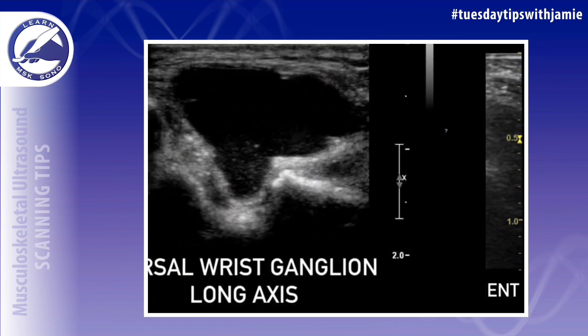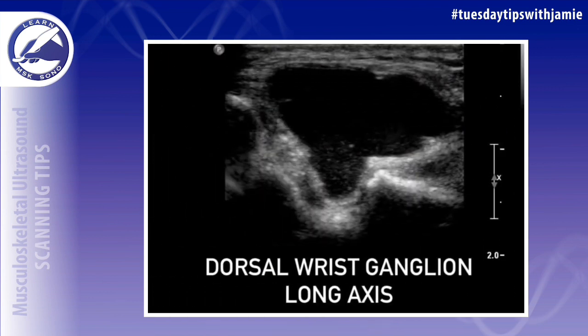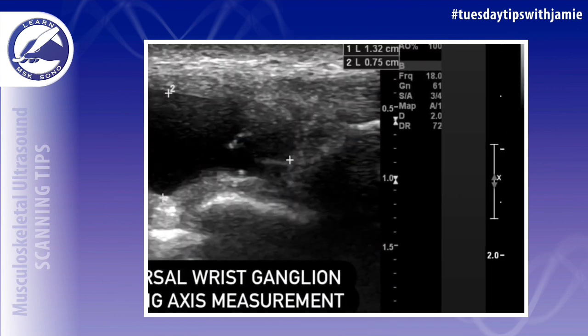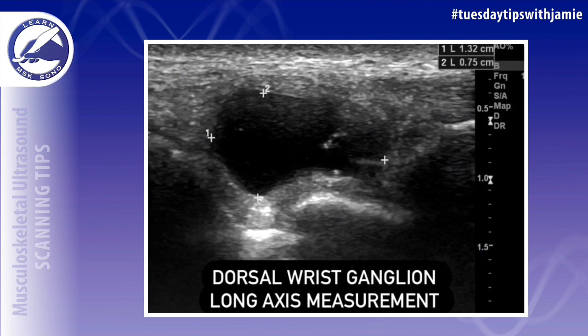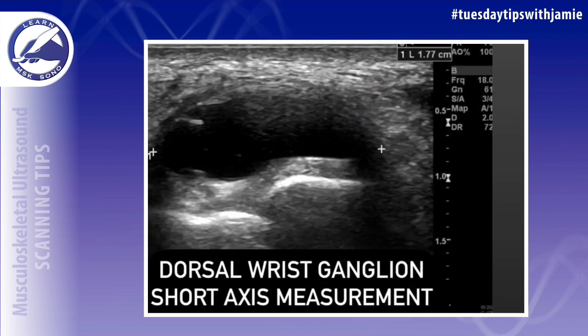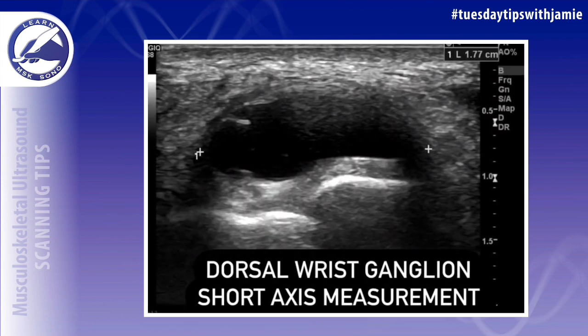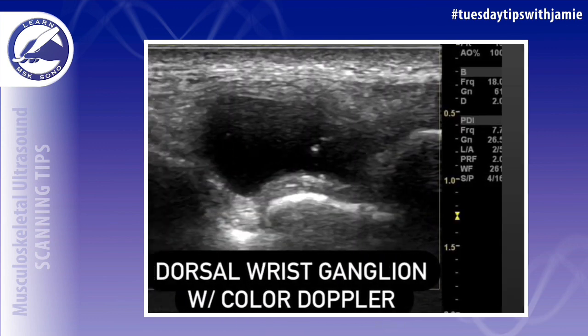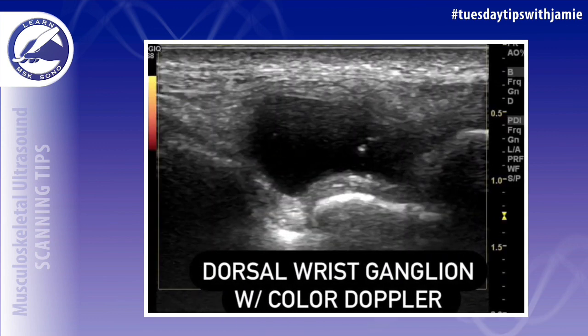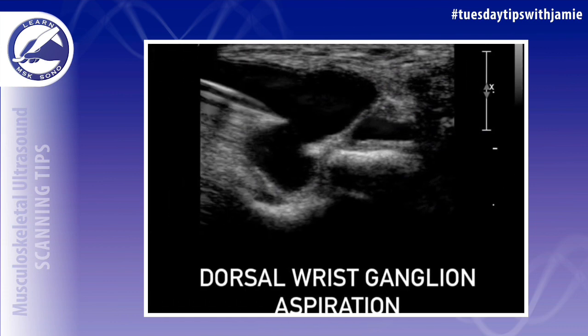The scapholunate ligament is the site where a dorsal ganglion cyst will live inside the joint capsule. You should measure it in the long axis, in the length and AP measurement, and then also in the short axis take a transverse measurement. You should also use color Doppler to assess the cyst for any vascularity within it, and you can aspirate if it's needed.